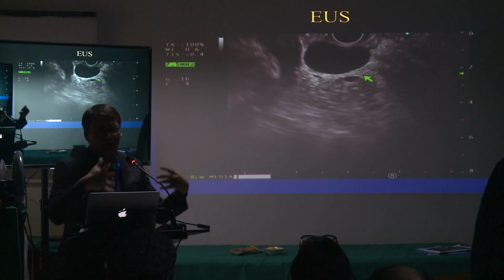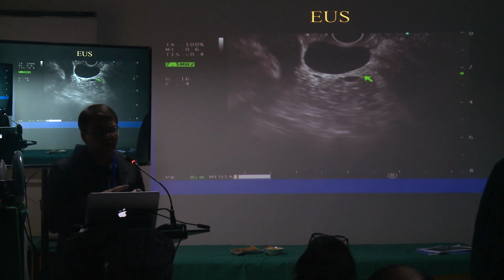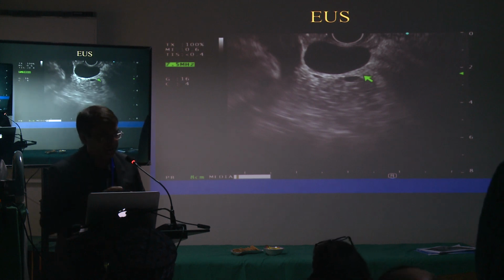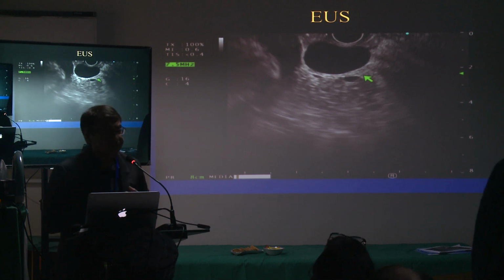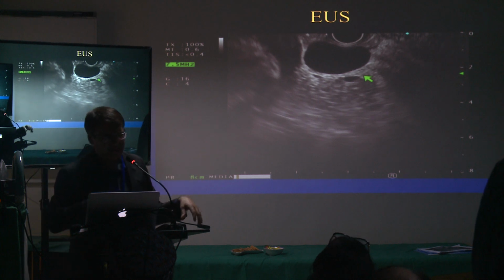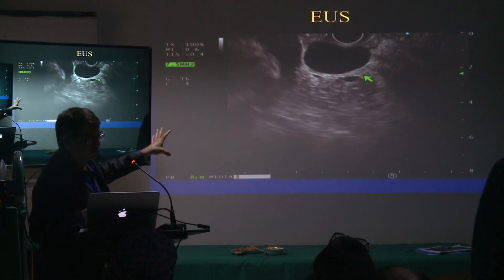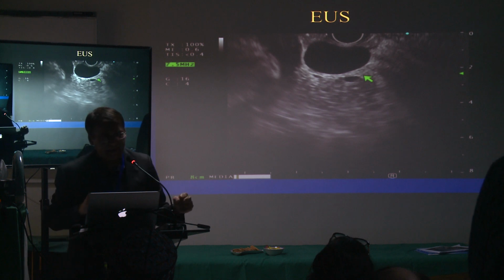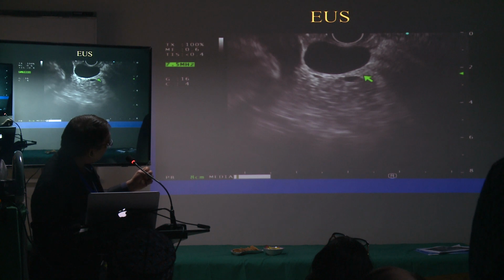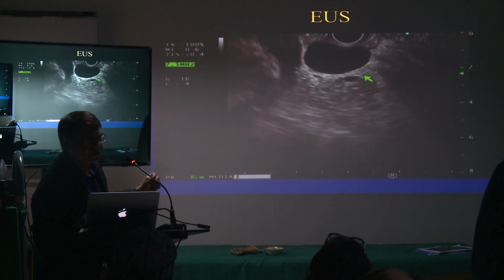Whenever you look at the cyst, what are the things you are looking for? Solid, yeah. One person at a time. So there's no honeycombing here, right? It's clean. And I don't think you saw any mural nodule. And what else do you look at? Wall thickness. Do you see it's a thick wall? No, it doesn't look like it. Relation with the pancreatic duct. Calcification.